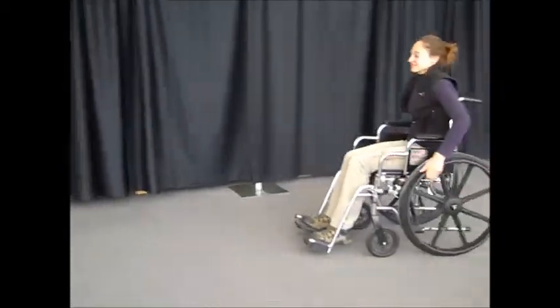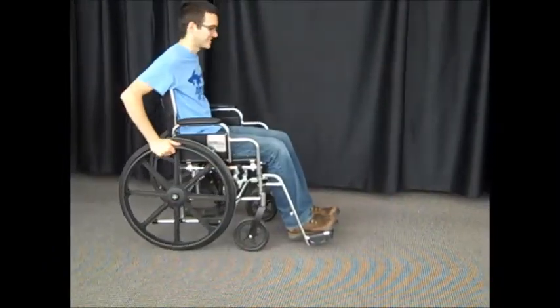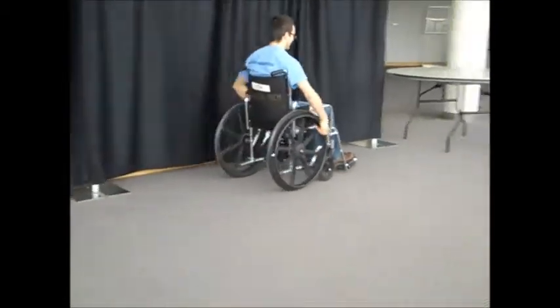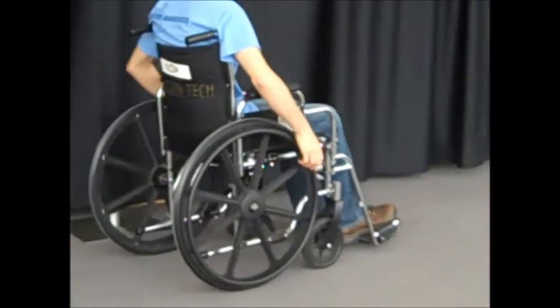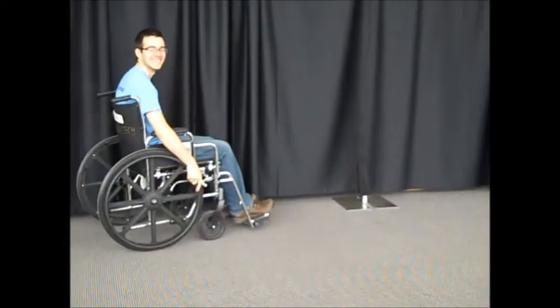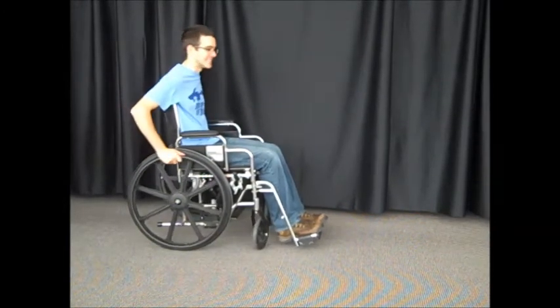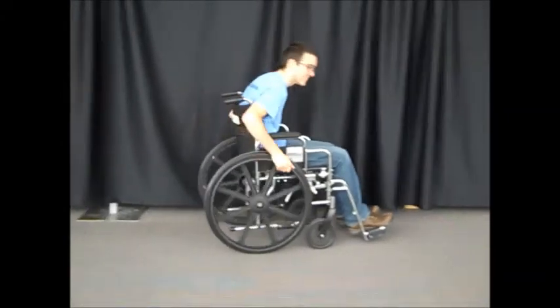The location could vary depending on the user's activities, and their positioning in the wheelchair. Different locations could include the wrist, elbow, biceps, and shoulder, particularly the rotator cuff. One such cause of these injuries can result from the force in the shoulder changing directions from the start of the push phase to the end of the push phase. Increasing the force at the end of the stroke can increase the likelihood of strain, as well as cause the user to become unstable and do a wheelie.